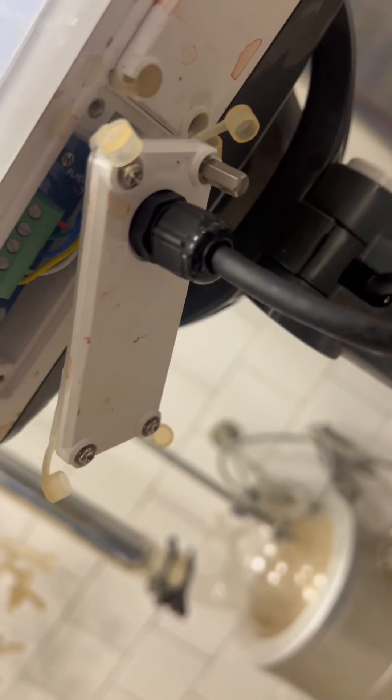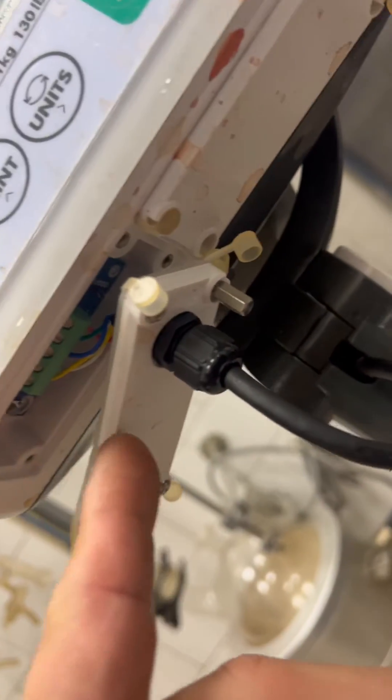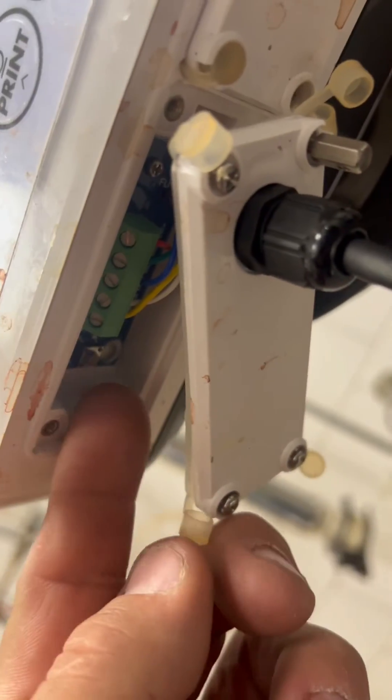But like most A&Ds, they have these cover plates. Usually whenever you see the seal bolt, that's where the button is. But you remove this, and underneath here there's a switch.